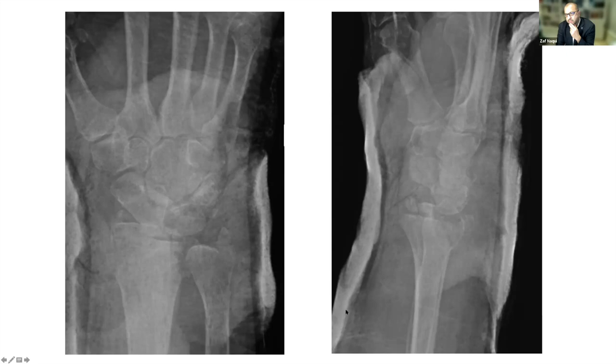I think one of the problems that I realized with X fix was that you put the X fix on and it doesn't reduce the fracture. So then what you do is you jack the X fix out. If you look at some of the post-op films from some years ago, you see a sort of centimeter open gap in the radiocarpal and the midcarpal joints. But then the fracture was reduced. By the time the fracture all healed up, they couldn't move their fingers anymore because you'd wrecked the soft tissues. So if you're going to do X fix, it's really important at the end, put your X fix on and make sure you can flex the fingers fully. Because if you can't, it's too tight and you have a great wrist and a terrible hand.